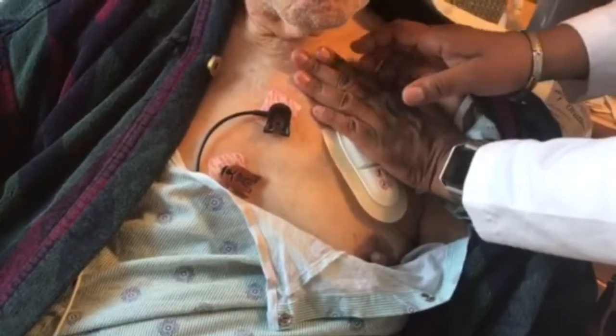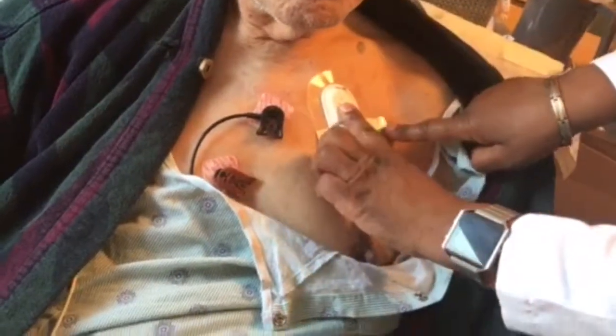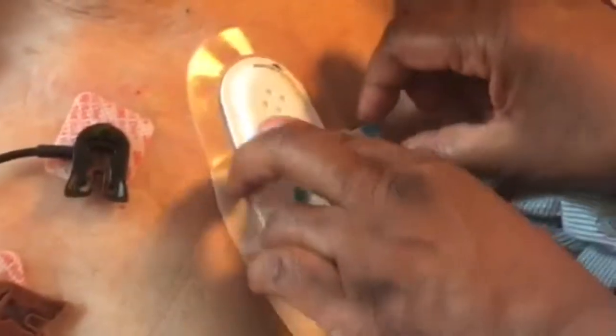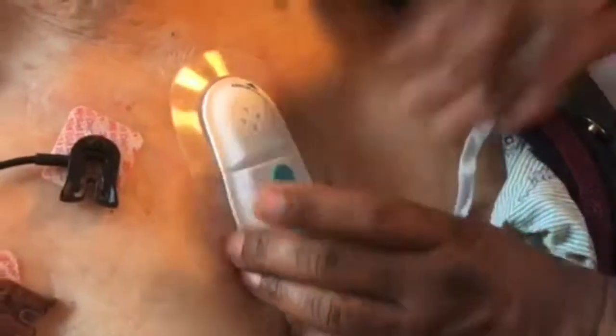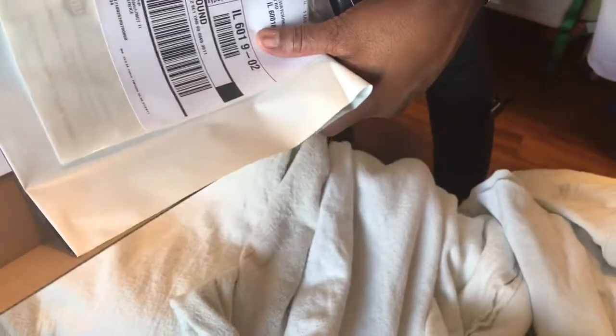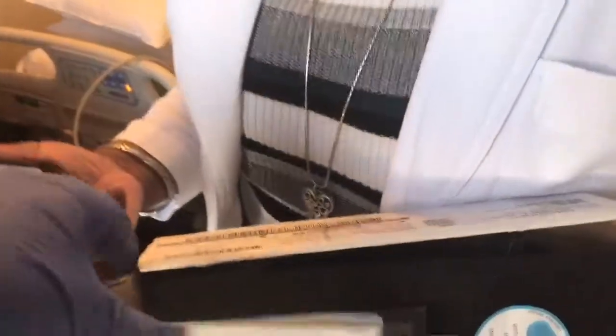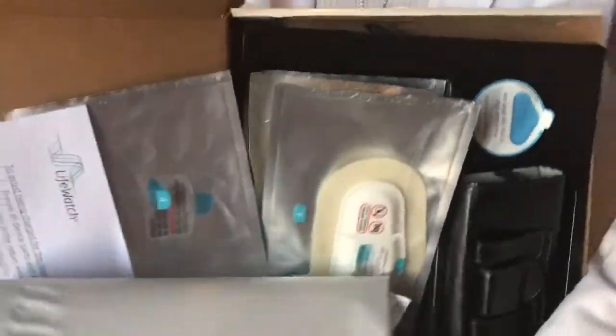All right, it's been about a minute — at least 30 seconds anyway. Now I'm going to take off number three. I just lift and peel, and you can see this is halfway between his nipple and his axilla. We're going to check his baseline — the serial number is on the side of the box.